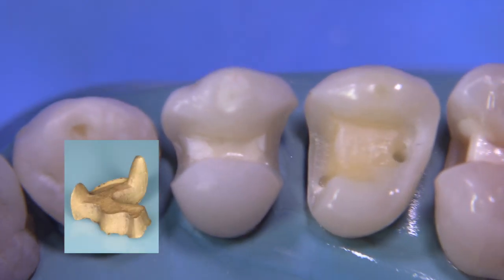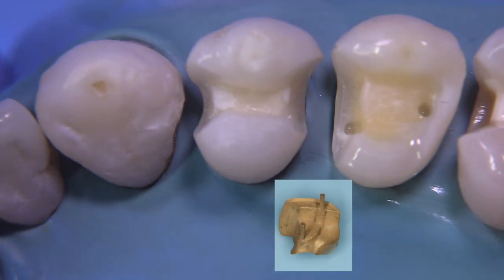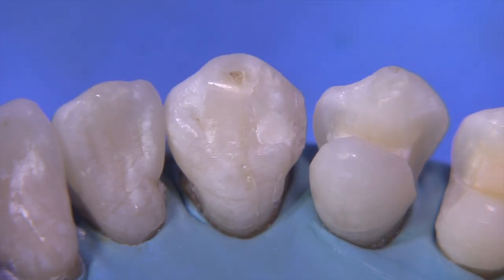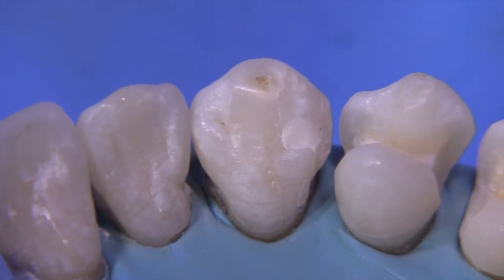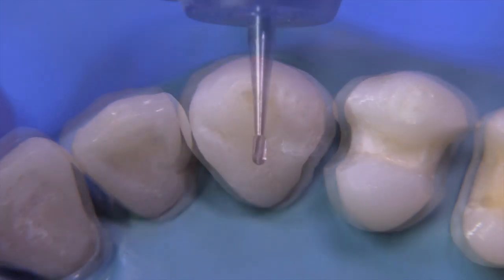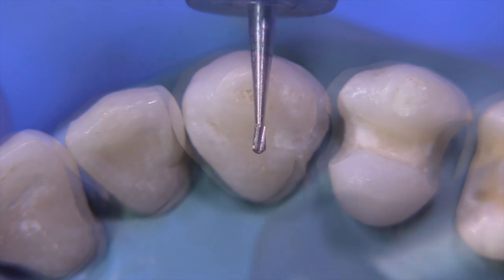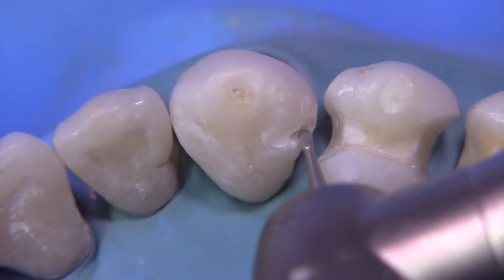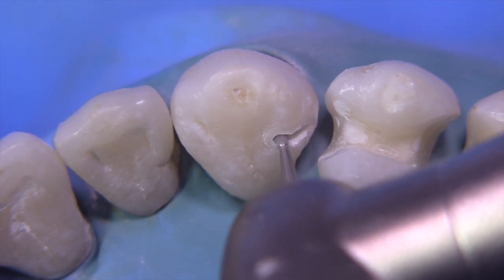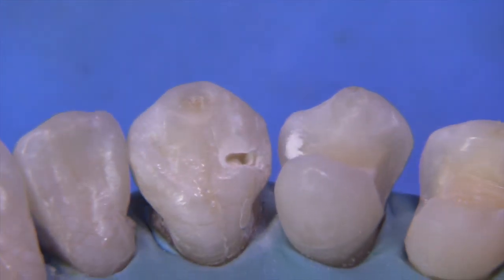We've done a couple of interesting preps like this hollow grind type prep here, and this pin-retained inlay over here. Today we're going to do something equally interesting that involves the use of a pin as well — a DL on this canine. We're going to start with the 330 burr to create our little slit, which we find very helpful to get the adequate depth for optimal resistance and retention form.